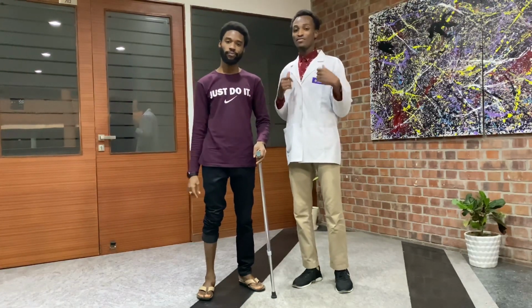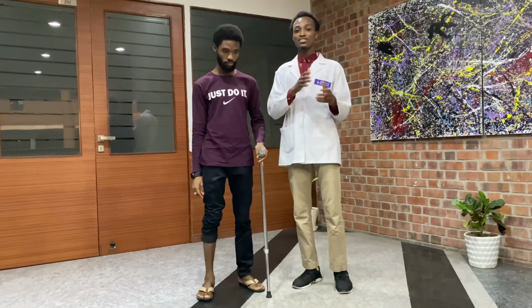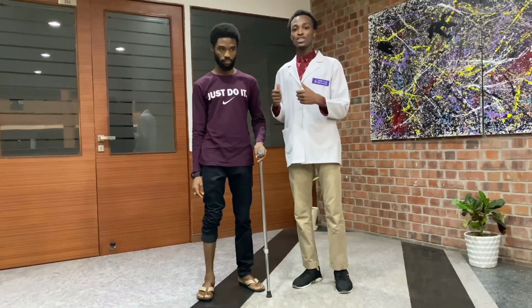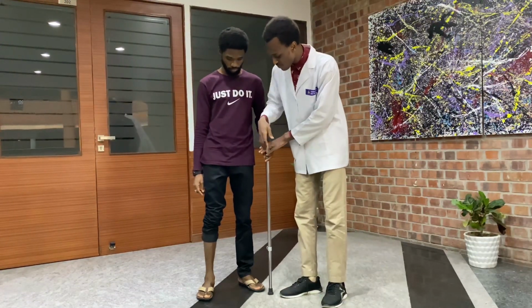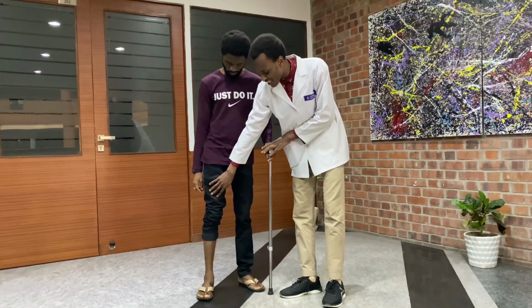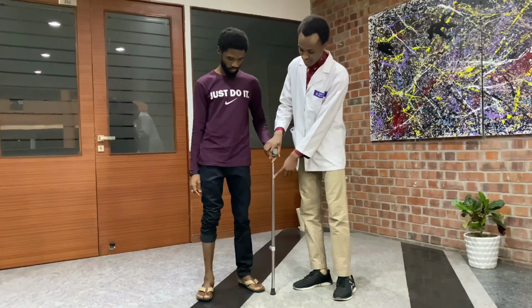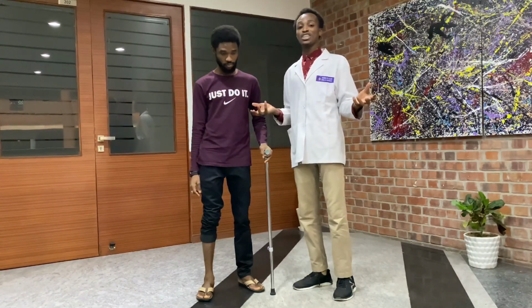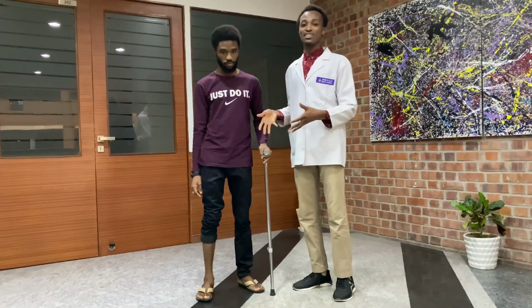The elbow is flexed 20 to 30 degrees, and it is literally used by holding in the contralateral limb, which is the unaffected side. When the patient has, like our patient here, injured his right limb, then the patient will hold the cane on the opposite side. There is a lot of debate concerning the side determination of cane, but literally, cane is held on the opposite side of the affected limb.